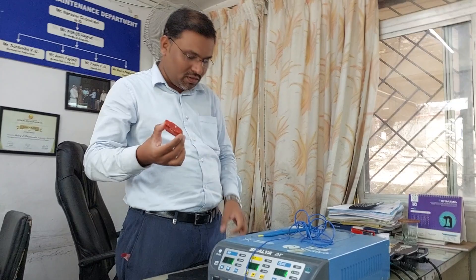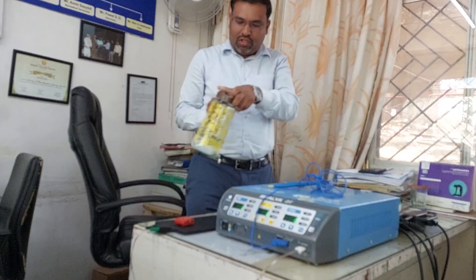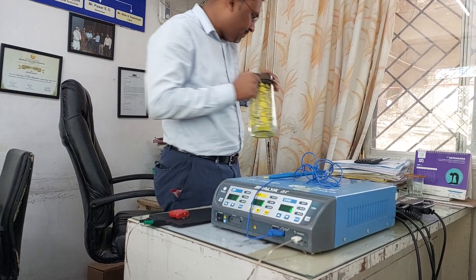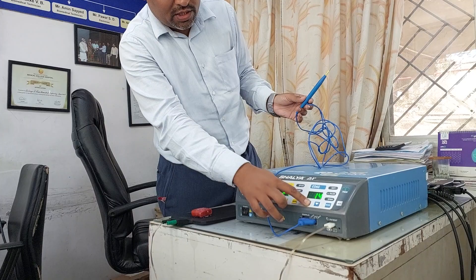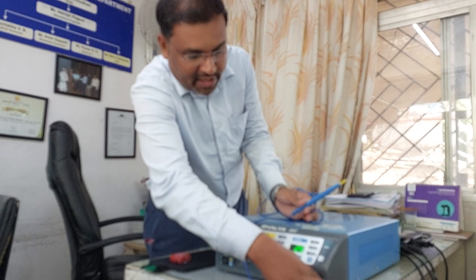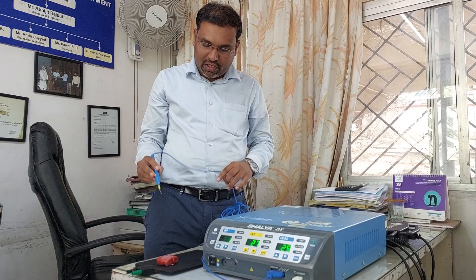For testing, take a sponge and put it on the patient plate, then put some water droplets on the sponge. Increase the cutting settings — the doctor will decide the values according to the surgery. Once the values are selected, if there is no red indication, that means it is connected properly to the patient plate. If it is not connected, it will give an alarm and red indication.